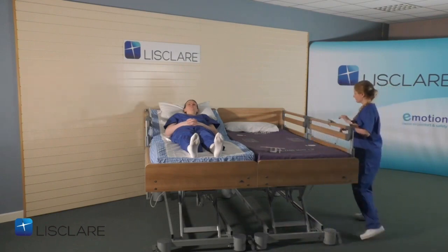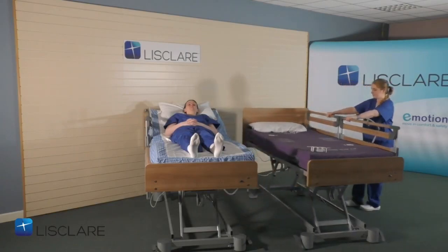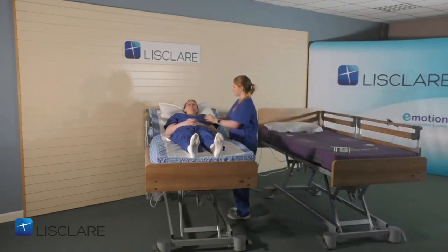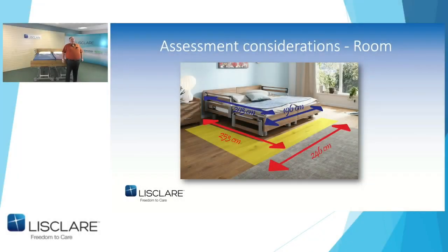And Cara's using now a proper procedure to undo the brakes and separate the bed, and gives her access to Eve. Cara's my eldest daughter that's doing the nurse part, and Eve's the patient, who's my youngest. And that will give you the consideration for the hoist working space required.